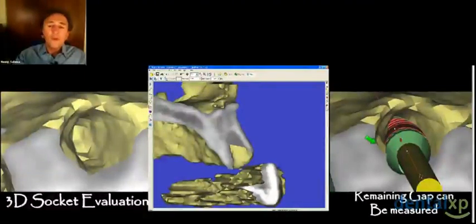And if you notice from a design standpoint, when we look at implant design, if you use an implant with platform switching capabilities, as in this figure, your distance from the labial plate is not the labial of the implant to the bone.